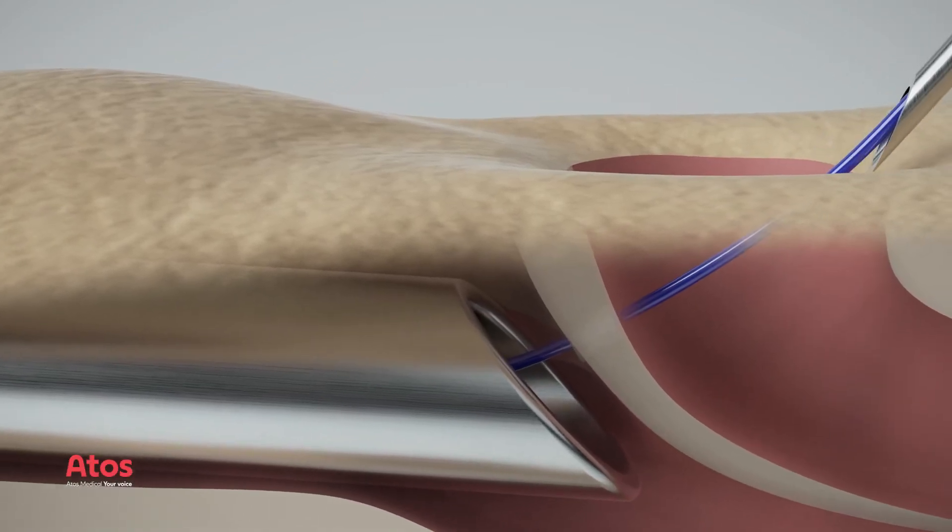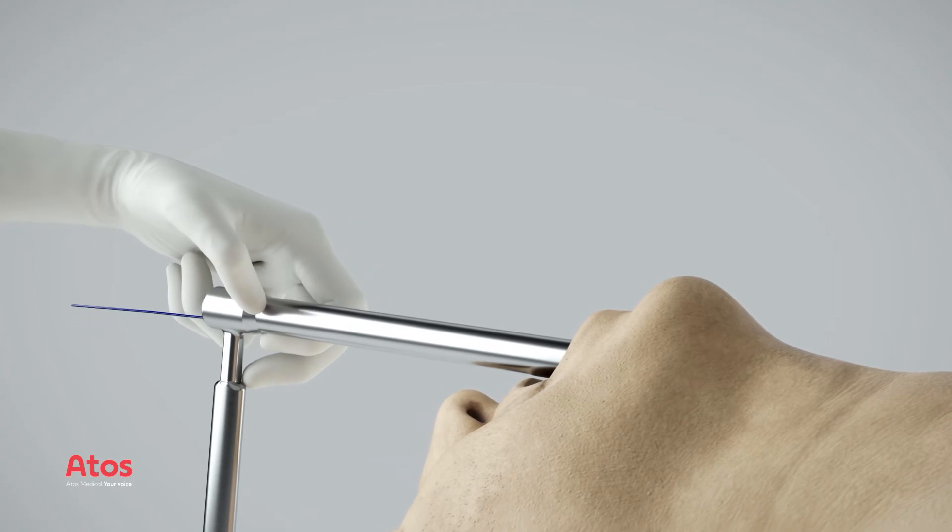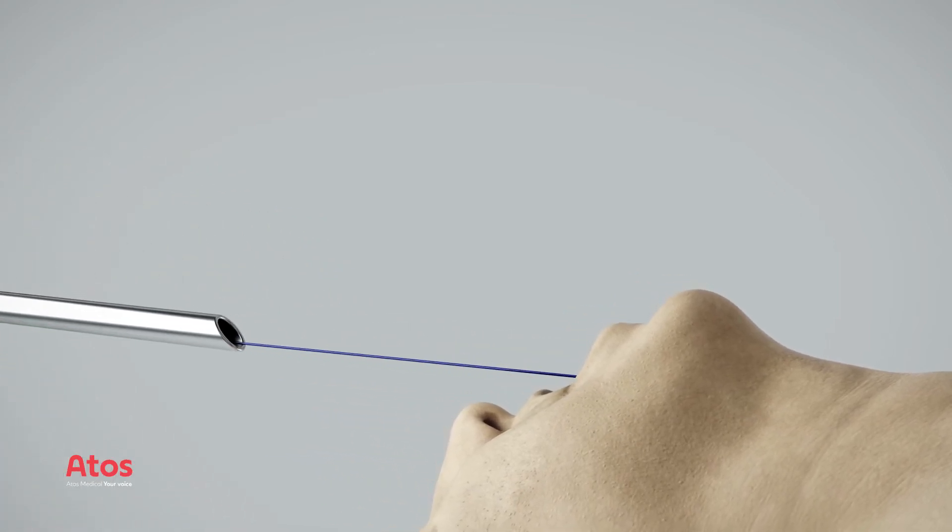Remove the puncture needle. Then remove the instrument. Only the guide wire should remain in situ before continuing.